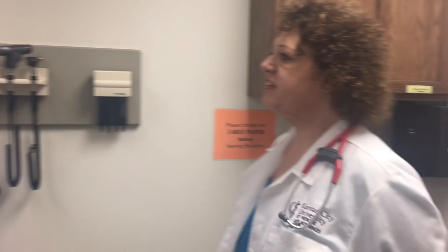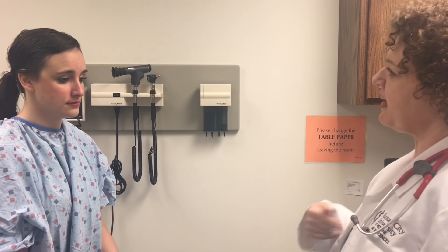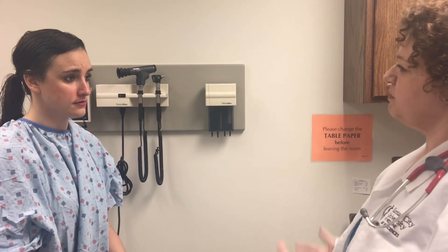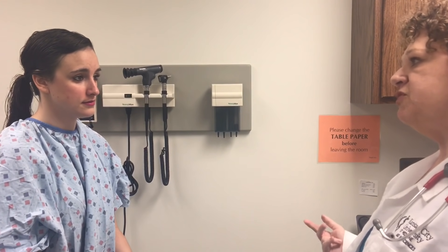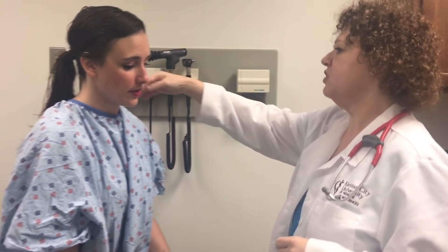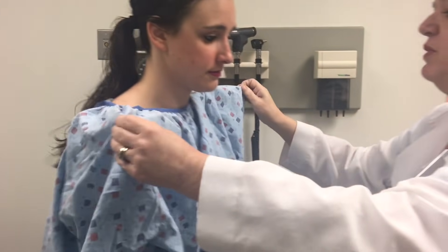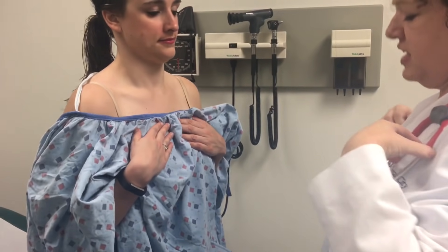I'm going to listen to four spots on your chest: right here, right here, a little lower than that, and then on your left chest wall. To get started, would you mind if I undid your gown so that I can listen on skin? I'm going to pull it down — I'd just like for you to support it. Thank you.